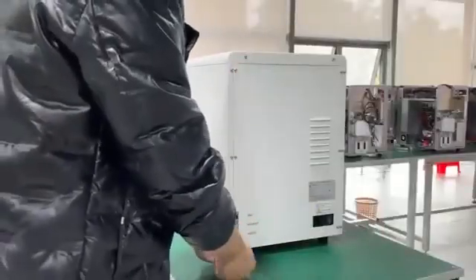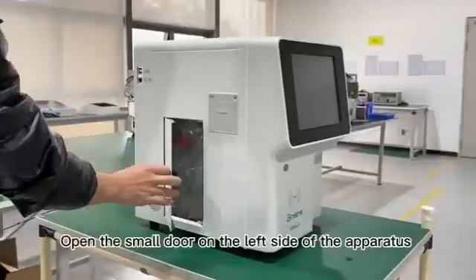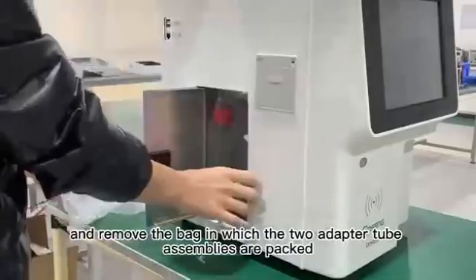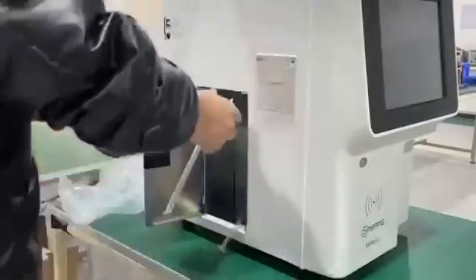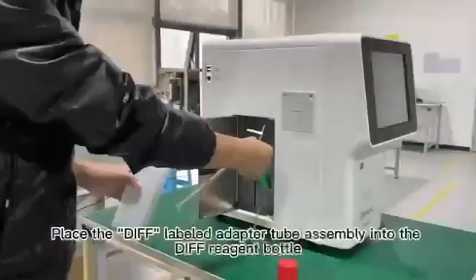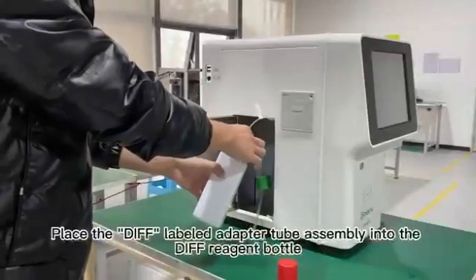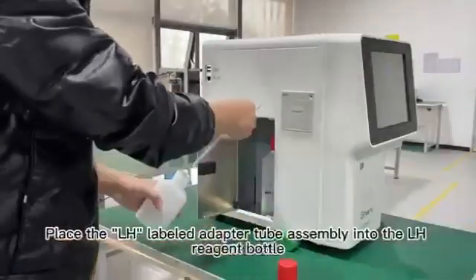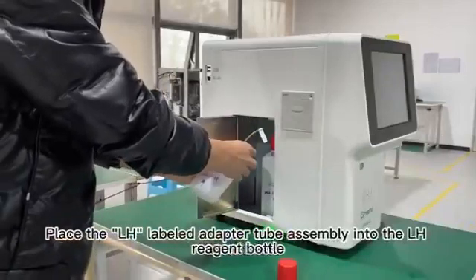10. Open the small door on the left side of the apparatus and remove the bag. 11. Place the LH-labeled adapter tube assembly into the LH-Reagent bottle.